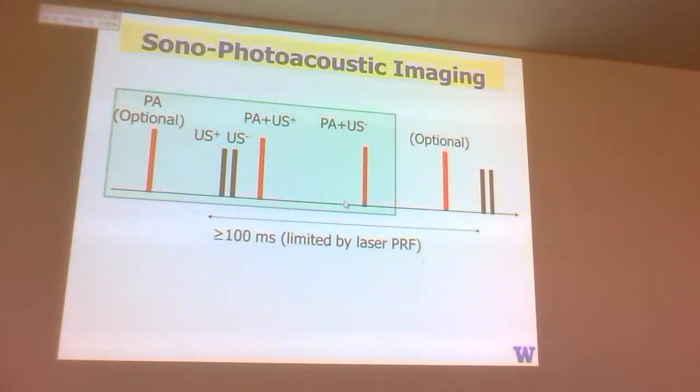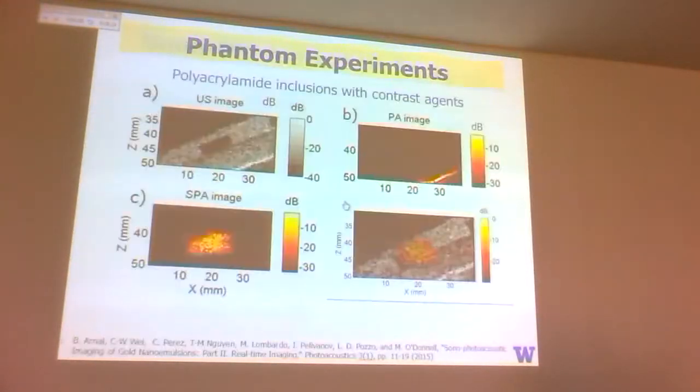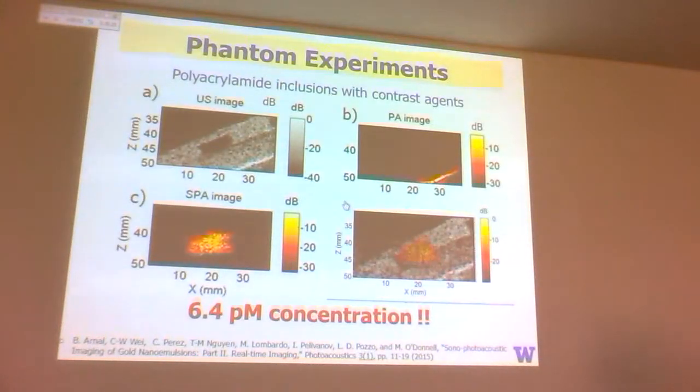You might get background signals, right? But this guy, when you go here, I get a huge signal from our particles, but the same background signals as the first pulse. So when I subtract them, the only thing I see is the particles. Okay? So I have a system which has the potential to increase the sensitivity by about 3 orders of magnitude, and the specificity has a background subtraction native to it. Let's go to that.